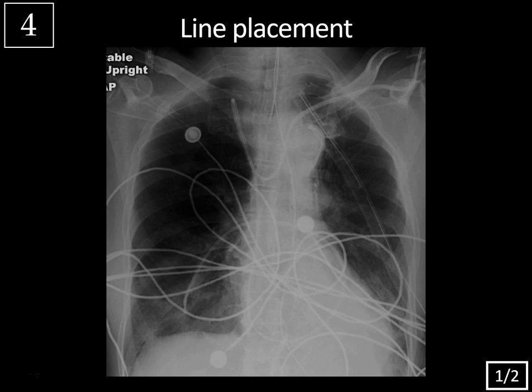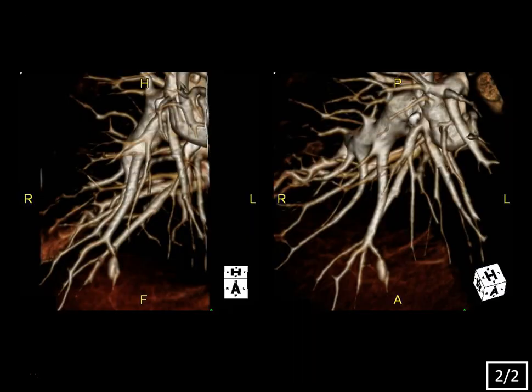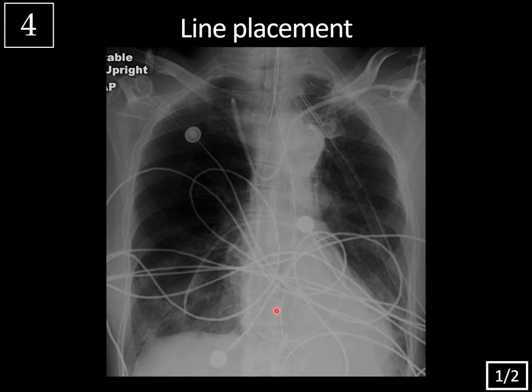Case 4: chest X-ray with a history of line placement and a 3D volume rendering from a CT angiogram. The X-ray is tricky because numerous EKG leads overlie the patient. You can see an endotracheal tube, a left apical chest tube, and a left subclavian Swan-Ganz catheter that loops up, extends into the heart, and then up and down the right descending pulmonary artery — which is a bit too far. Ideal positioning is within one centimeter lateral to the mediastinal margin, not beyond the pulmonary hilum.